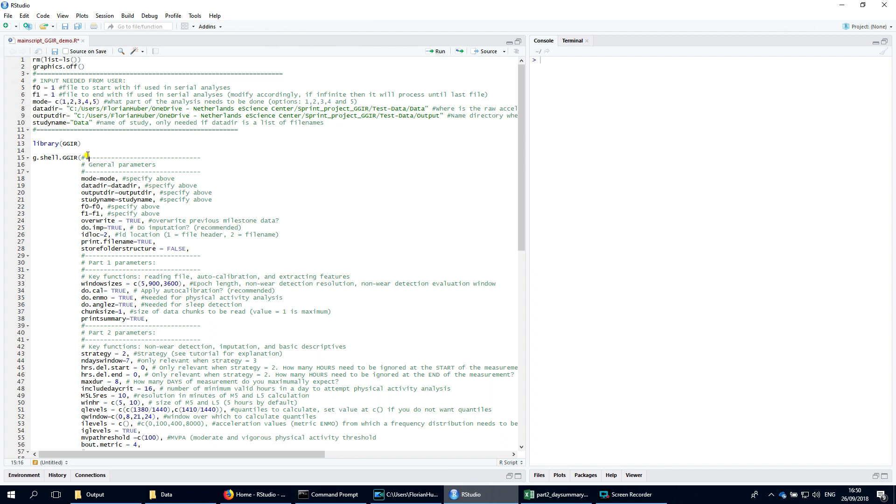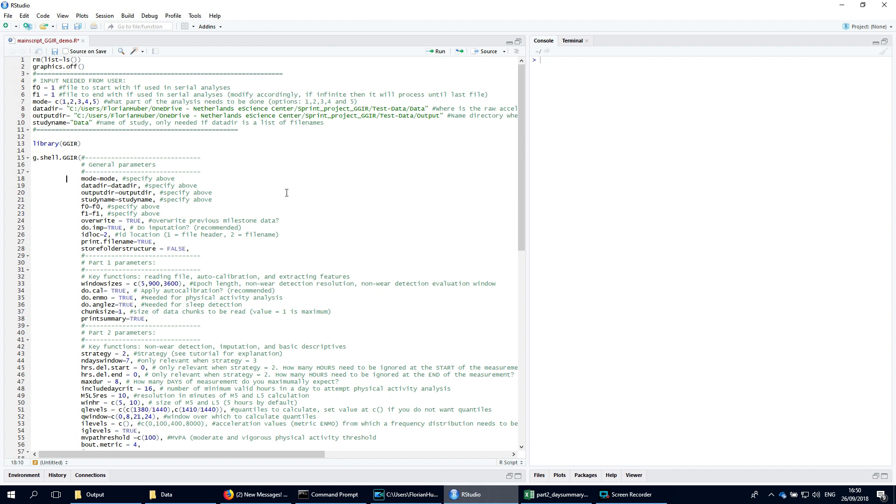GGIR comes with one shell function that allows you to interact with all the functionality GGIR has to offer. The shell function is called g.shell.ggir. This function accepts a lot of input arguments that relate to all the functionalities of the package. In this tutorial I will only highlight and explain a few of them.